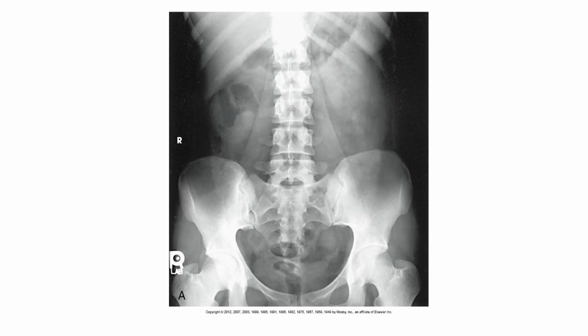Okay. All right. Moving down into the pelvis, we can see both wings of the pelvis. Those are called the ilia. Okay. Sacroiliac joints, the sacrum in the center. See how the sacrum looks symmetric, but the right side of the pelvis looks skinnier than the left side of the pelvis. That's slight rotation. It's just noticeable.